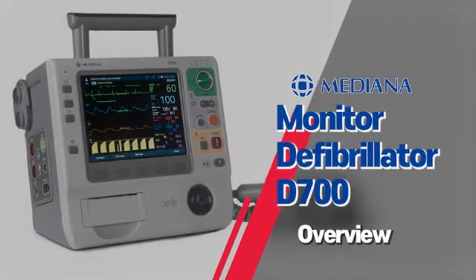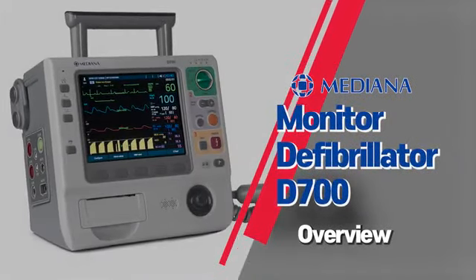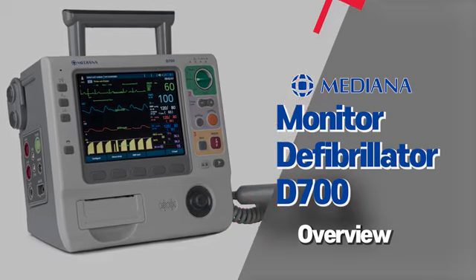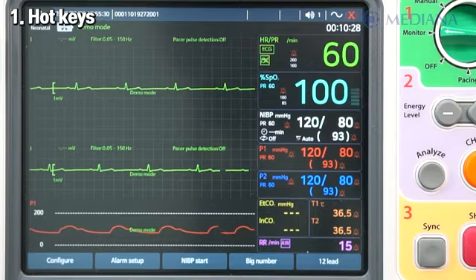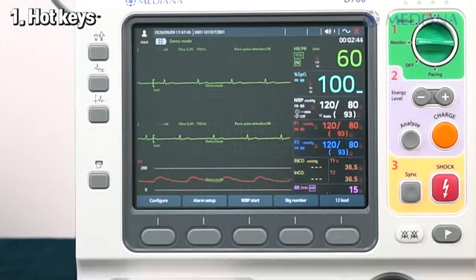This video is an overview of monitor defibrillator D700. Here is the front panel of D700, centering on the central LCD monitor. On the left, there are hotkeys.